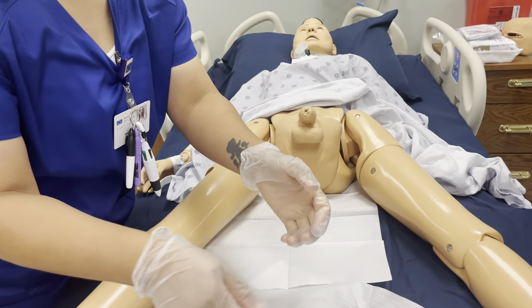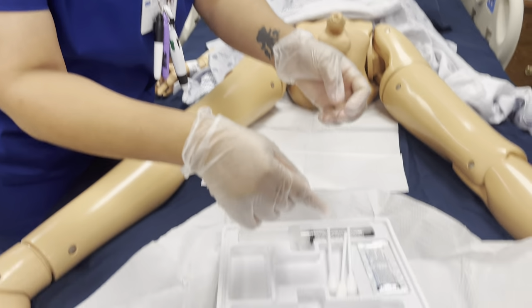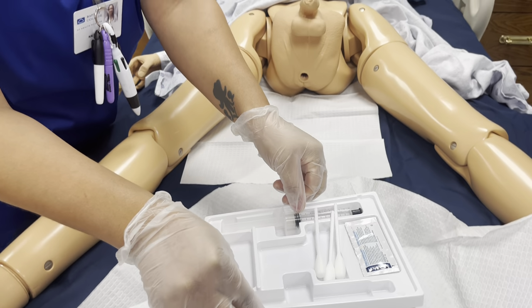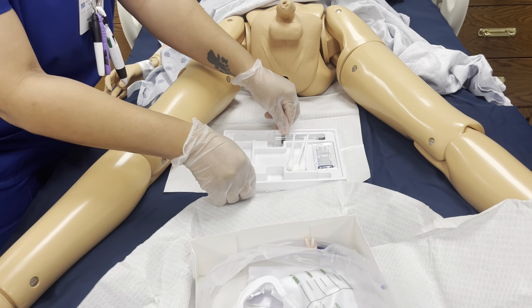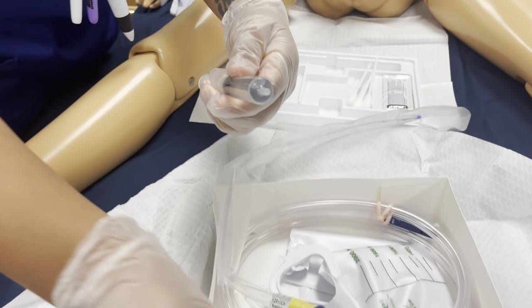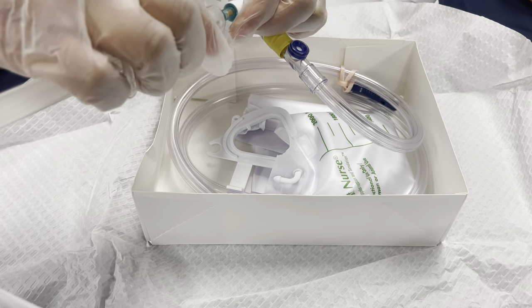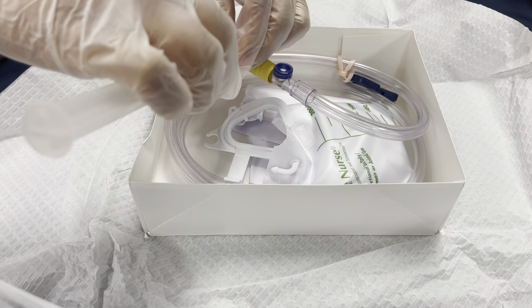Now, I would have opened my Q-tips when I had my gloves on. Now I'm going to take this out. Pull this here. Take this. Just put it in there, right?